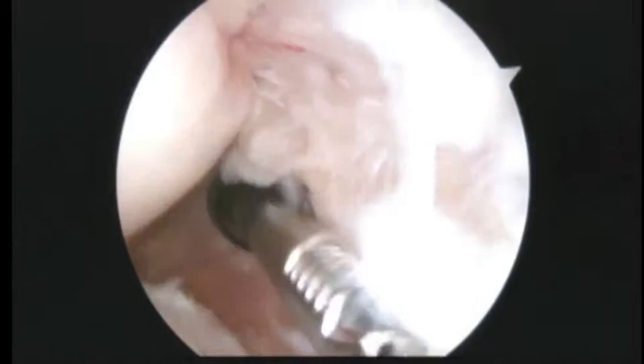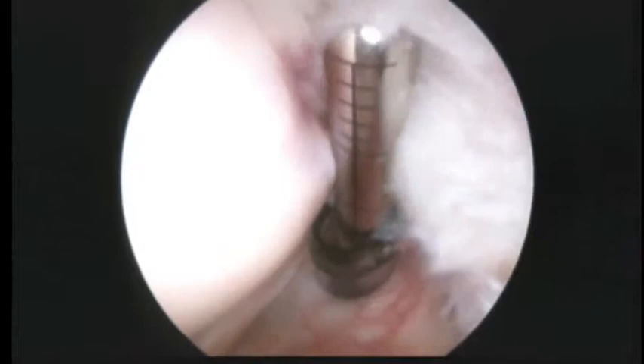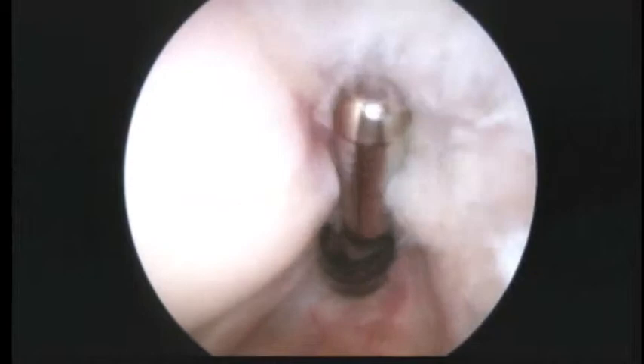Now I want to look up at the rotator cuff — here's the tear in the rotator cuff tendon. It's a significant tear, which we already know, and we know that it's essentially full thickness based on the studies, the ultrasound and the MRI scan.